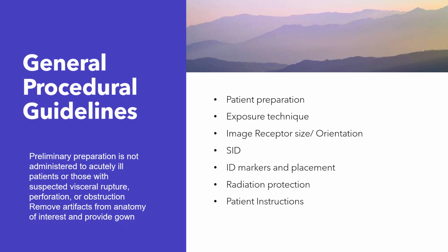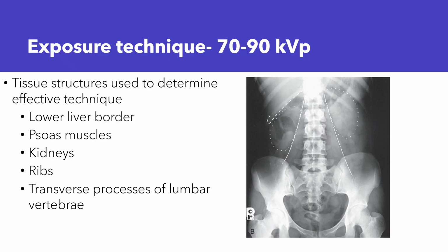Exposure technique I'm going to get into on an upcoming slide. Going to expand on that, as well as all the rest of that stuff. And so let's get on with it. All right. So exposure technique.